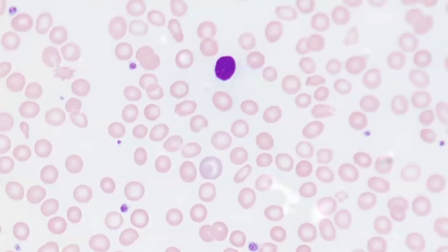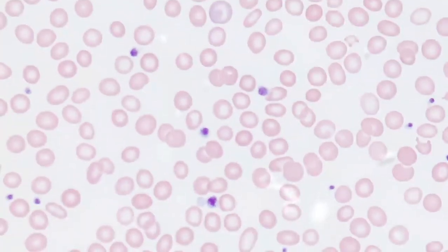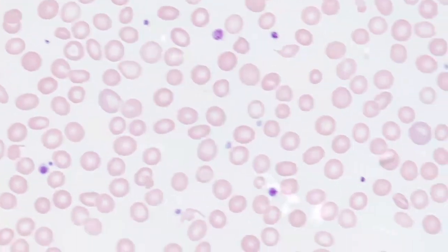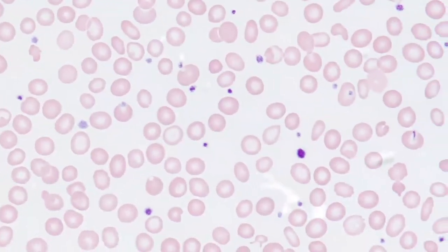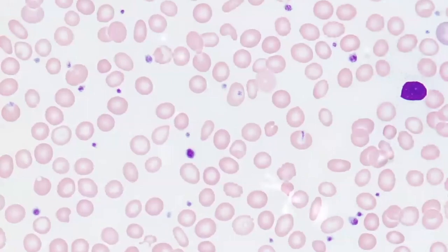Thrombocytosis also frequently accompanies these iron deficiency anemias, and here we can see our guess at low power confirms that there is an increased number of platelets than we typically see. But again, we would want to confirm this with the automated platelet count that comes with the peripheral blood smear.